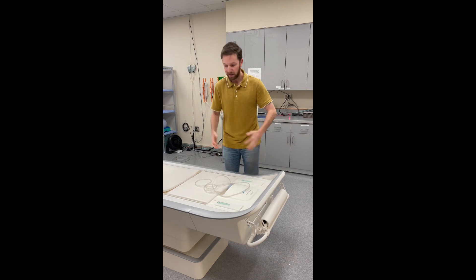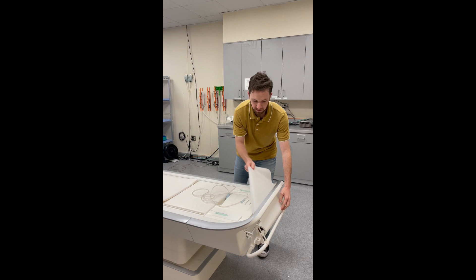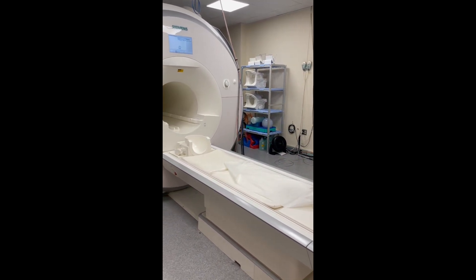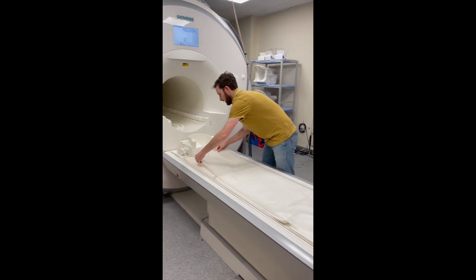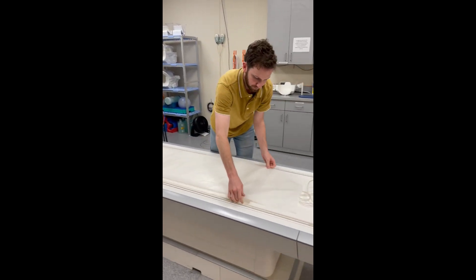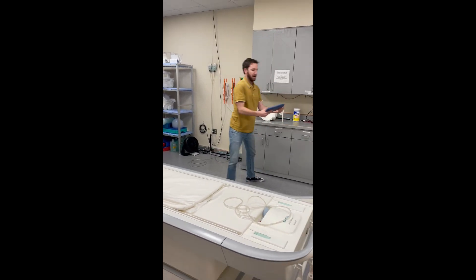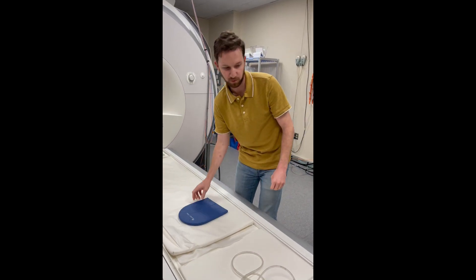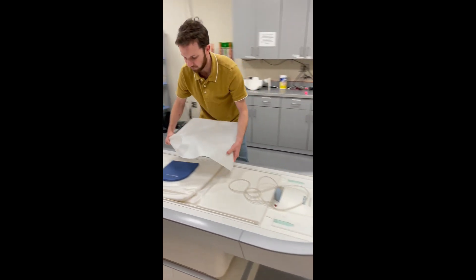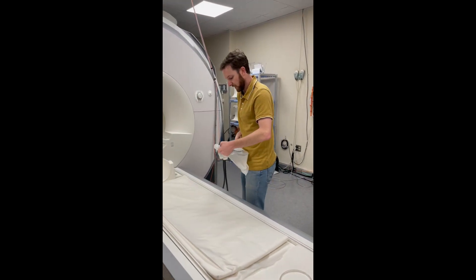We're going to begin by making sure that the scanner bed is prepped for our upcoming session. We're going to go ahead and pull a sheet of bed paper and tuck it in underneath the cushion to make sure it stays in place. We're also going to grab a head cushion so that our participants are comfortable during their MR exam, and cover the head cushion with bed paper as well for sanitary purposes.